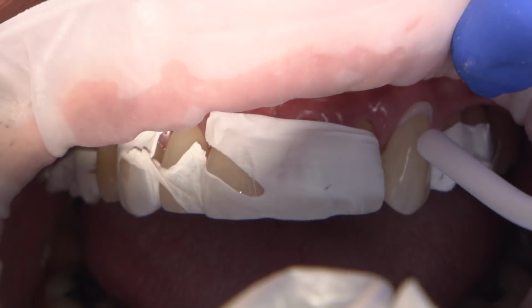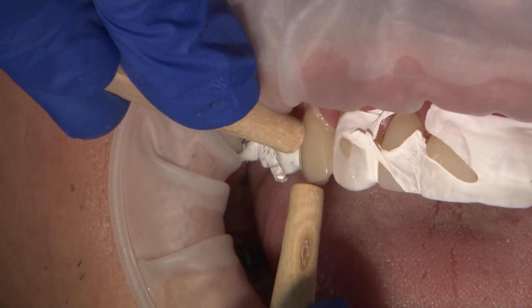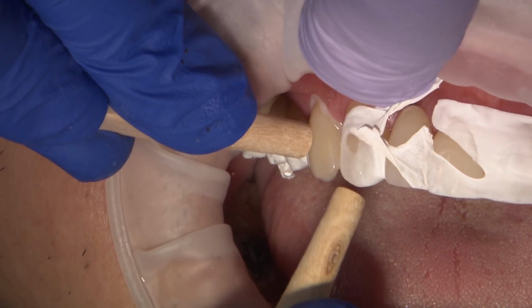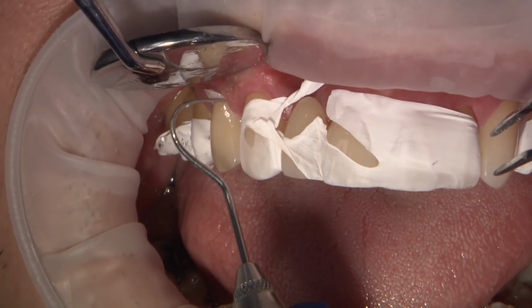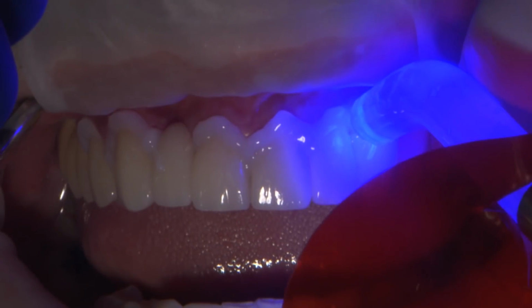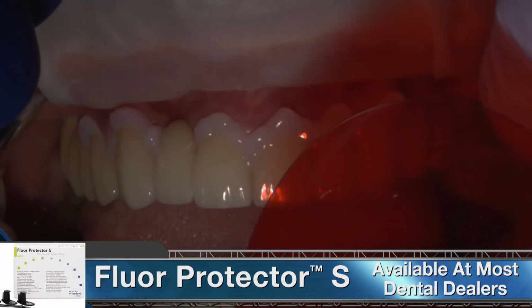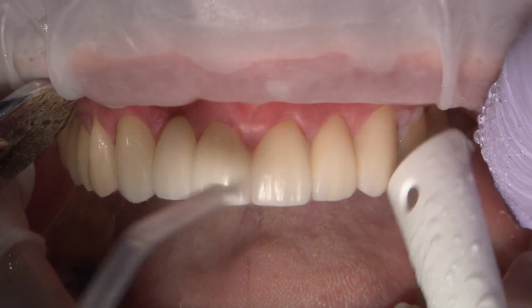Here's another tip. I find it easier when Will, my assistant, preloads the veneers and passes it on a surgical suction tip. Carefully not to place the vacuum tip too close to the edges of the veneer so it will not suction the cement while seating. Then I will ensure a full seat of the veneers using wooden sticks before polymerization. After removing all the excess, one last polymerization stage is performed after the application of the oxygen-inhibiting glycerin gel.